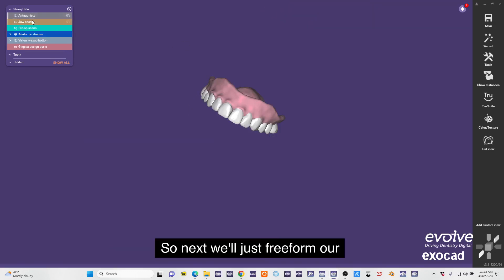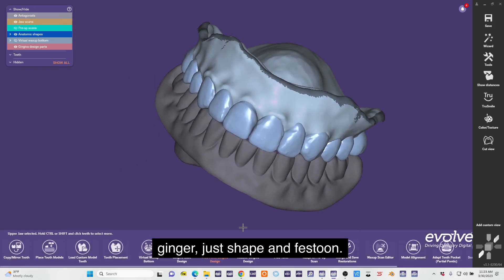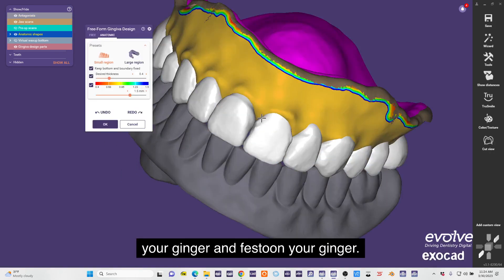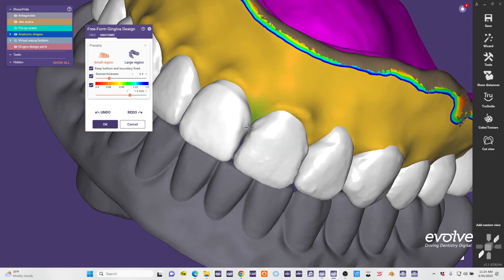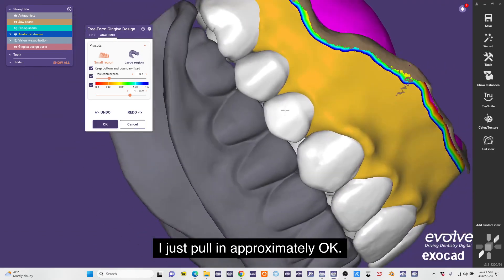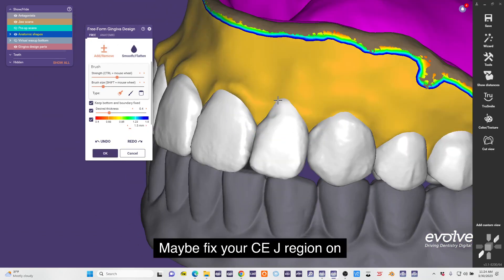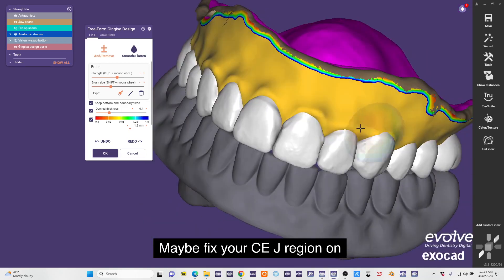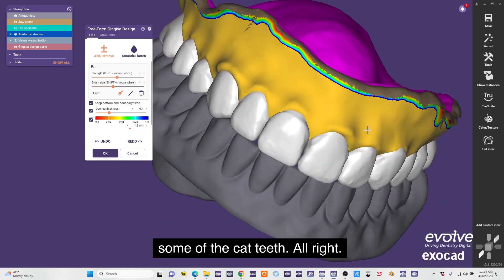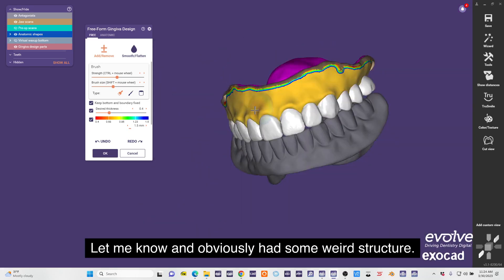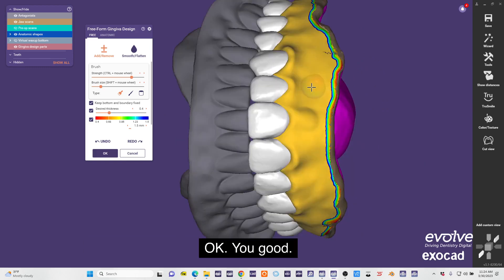Next we'll just free form our gingiva - just shape and festoon. You can shape your gingiva and festoon your gingiva. I just pull it approximately, maybe fix your CEJ region on some of the CAD teeth, and obviously add some weird structure.